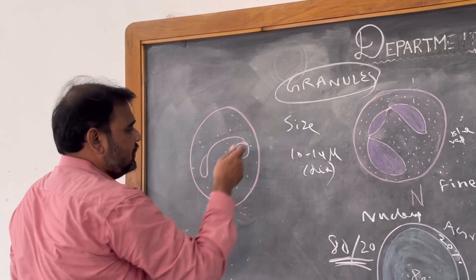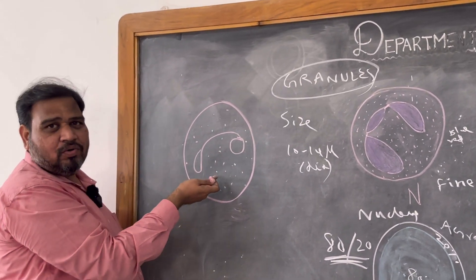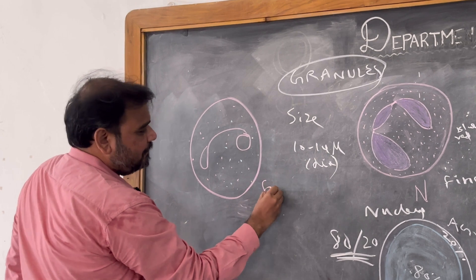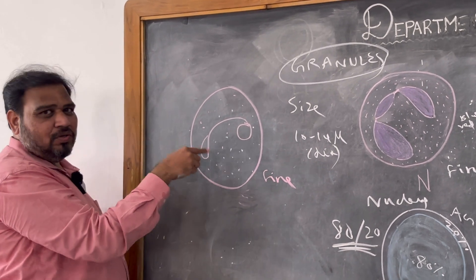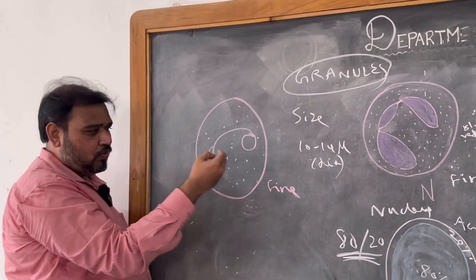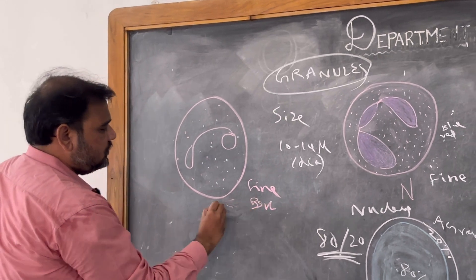First itself I told: it is granules fine or coarse? Fine. Color: is it taking both eosin hematoxylin, red color, blue color, or single color? Both. So obviously this is neutrophil.